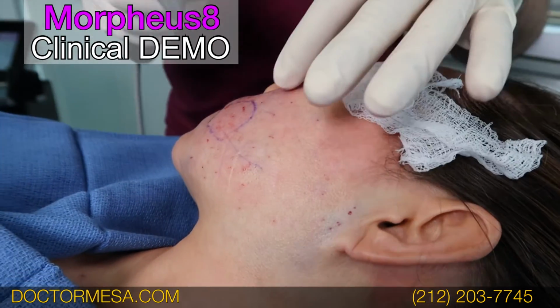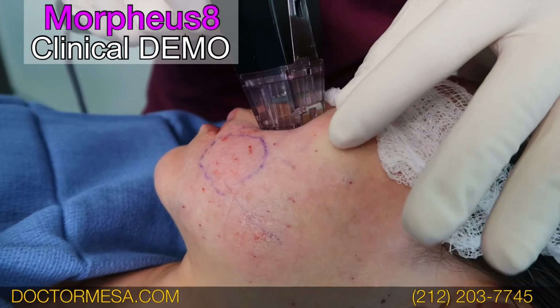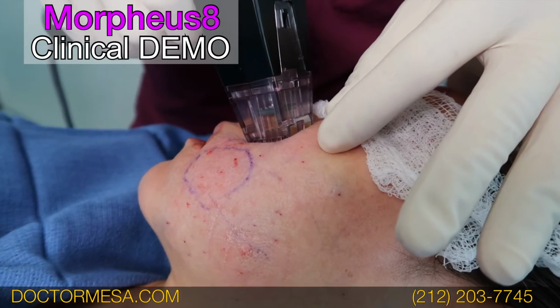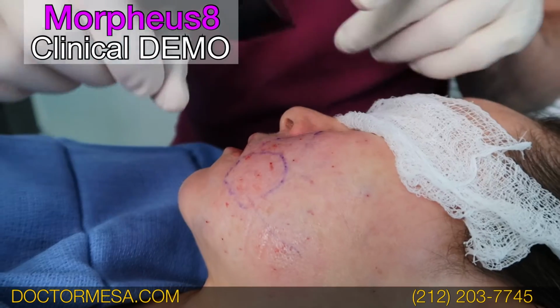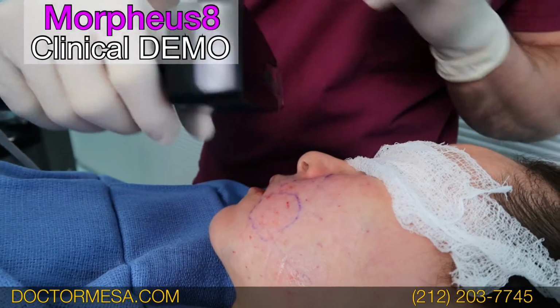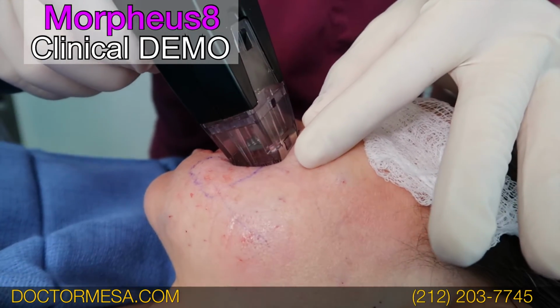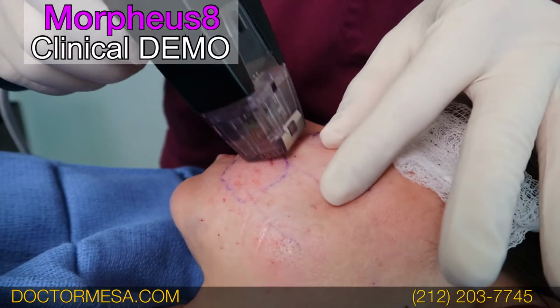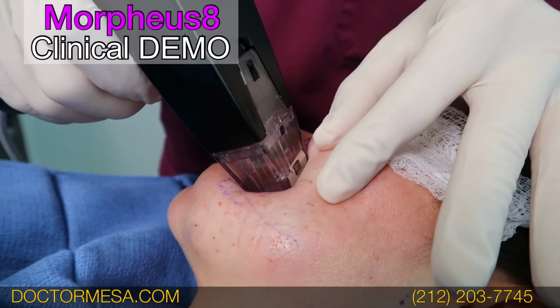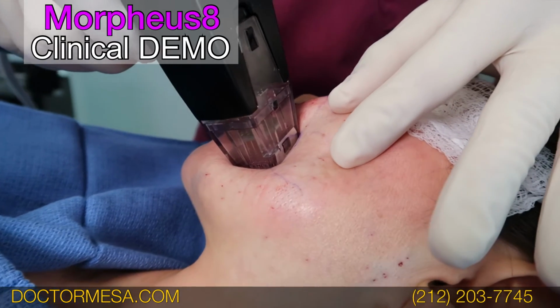So this is the first pass. I'm going to do a second pass. Okay. Every time the energy is released, you can see here there is a light, and also there is a noise in the device that tells me that the energy has been delivered. Continue.